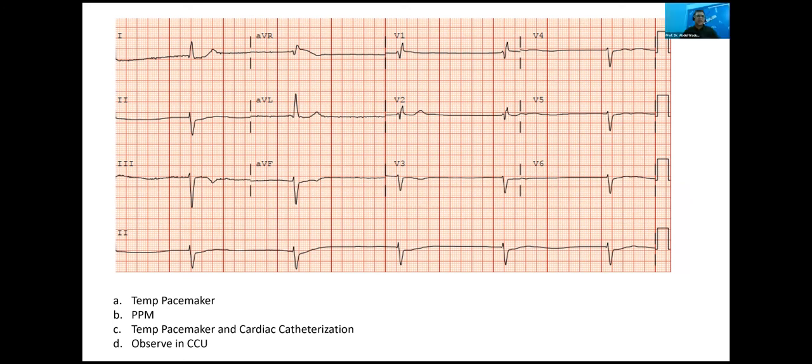This patient has right bundle branch block with left anterior hemiblock, and now has also developed a very slow rhythm. So this patient is at risk for developing asystole or complete heart block and a persistently very low ventricular rate. Exactly. The block is probably infra-Hisian and unreliable. Right, exactly. We cannot take a chance. If this patient goes into trouble, then we'll be liable.